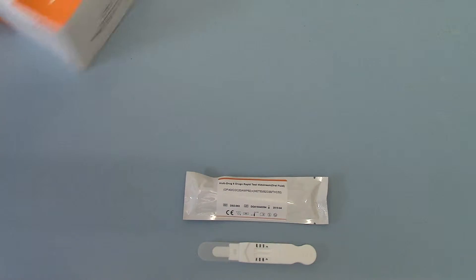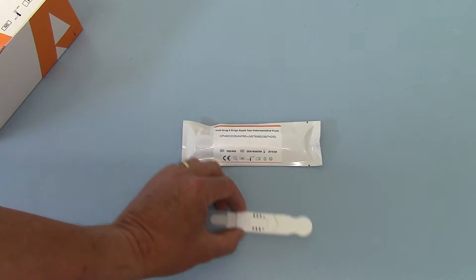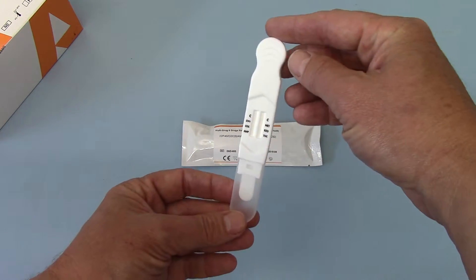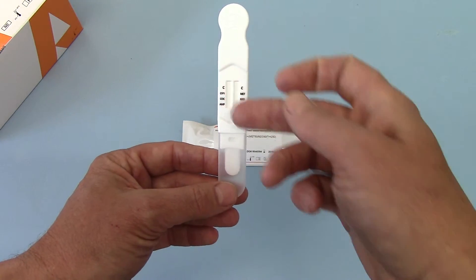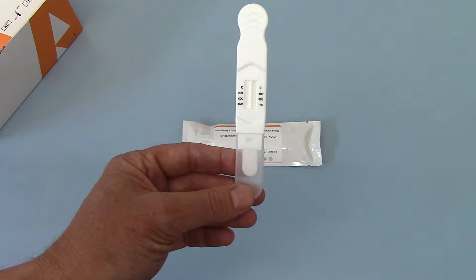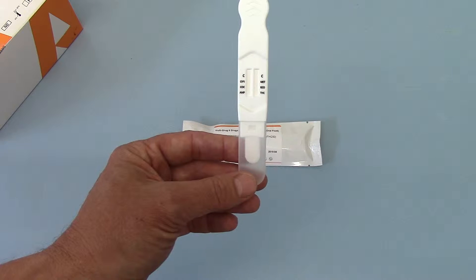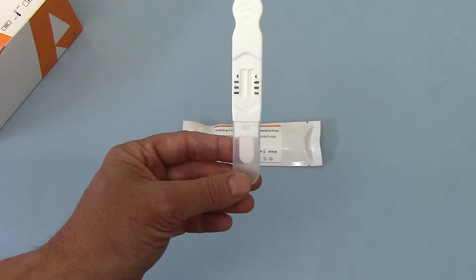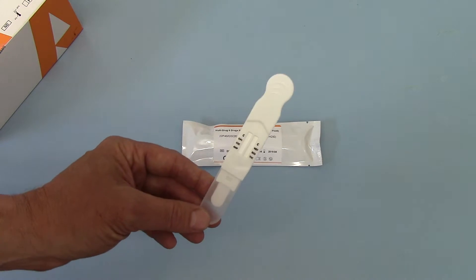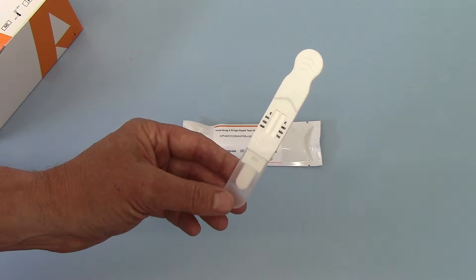Inside the box you get a full datasheet plus 25 individually foiled tests — this design here. This is simplicity itself in a saliva drug test. You've got two membranes, each of which will run and give you a control line marked with C, and then the drug abbreviations down each side giving you three tests on each column. So this is a six-drug test giving you individual results for opiates, cocaine, amphetamine, methamphetamine, benzos, and cannabis — an ideal combination for most healthcare and workplace screening, covering most of the common drugs of abuse.